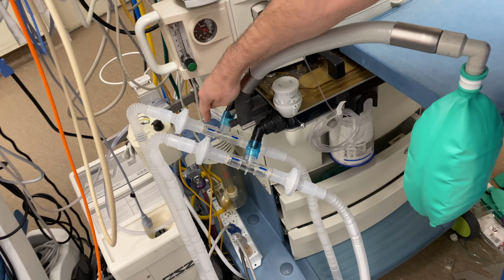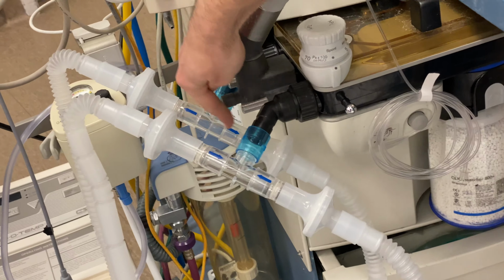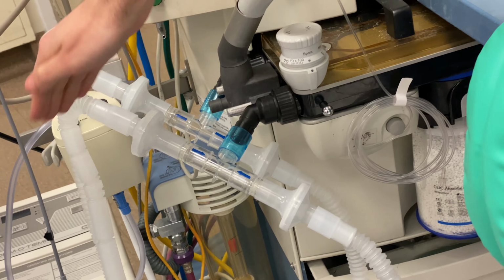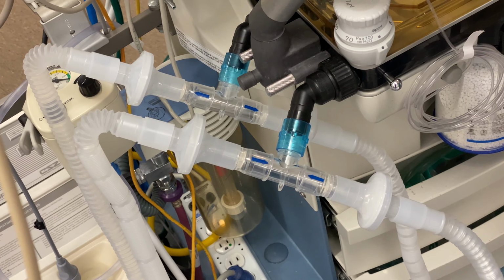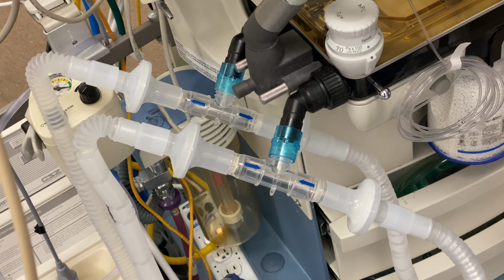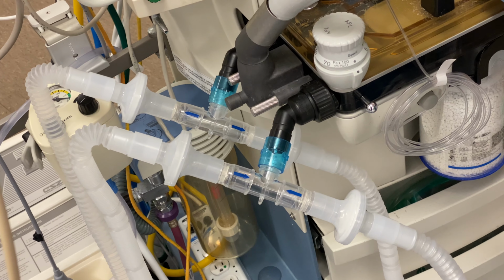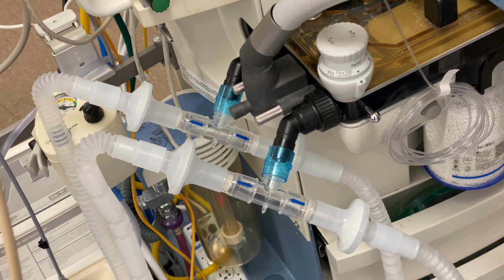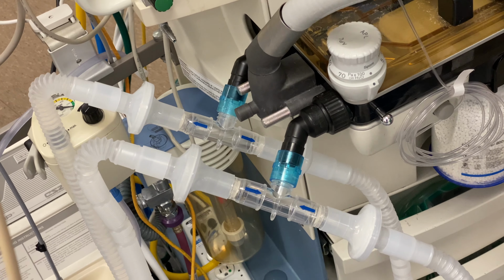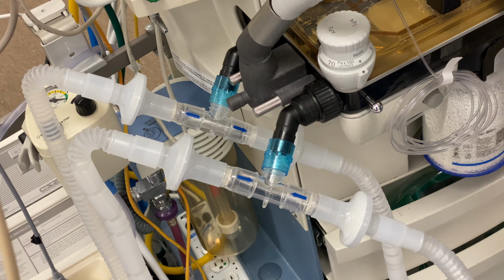And you'll note at the inspiratory limb, there are one-way valves, followed by the standard ventilator filters. And these are oriented in the correct direction for inspiration and for exhalation. In particular, the valves are also important for decoupling the pressure regulators. It's an important detail that we'll discuss in the paper that we're going to write about a circumstance which is somewhat rare but could be potentially very problematic for patients. But again, these one-way valves in this position address this issue.